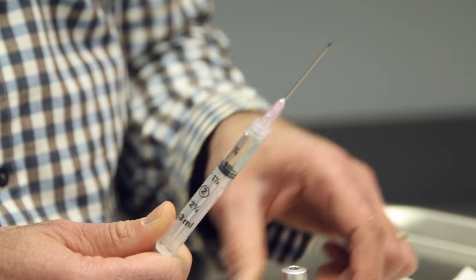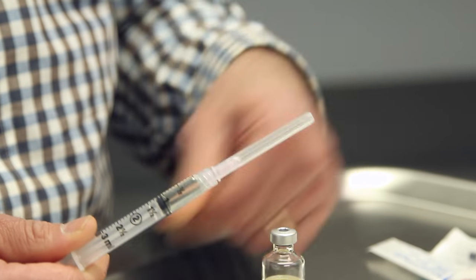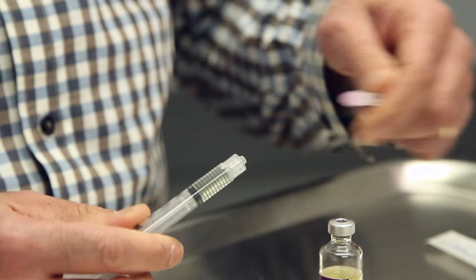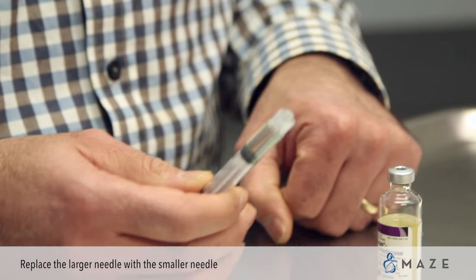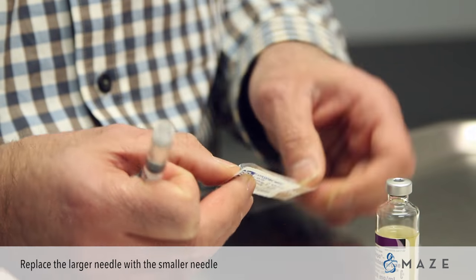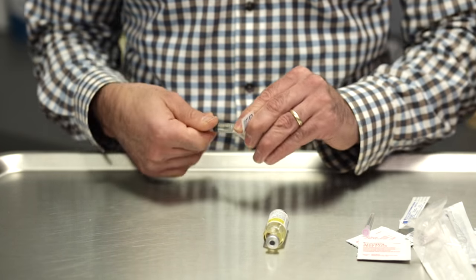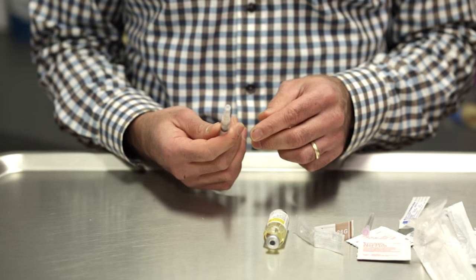Put the top of the stopper back on the needle, then remove that needle and apply the smaller needle, which you will use for the injection. Now you're ready to do the injection.